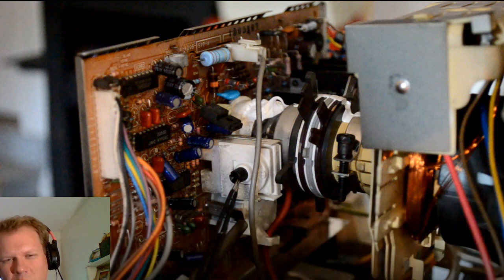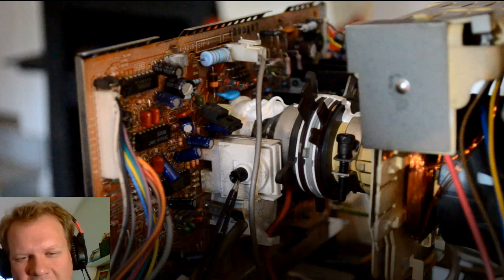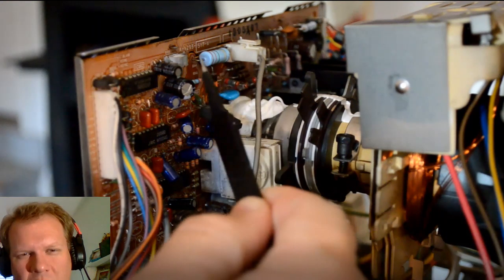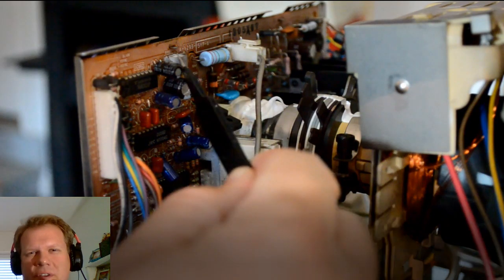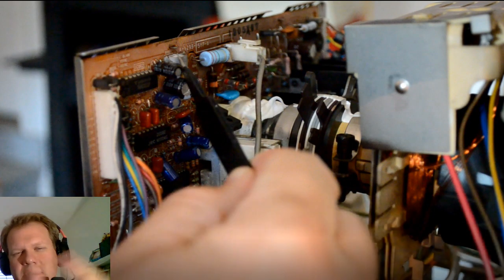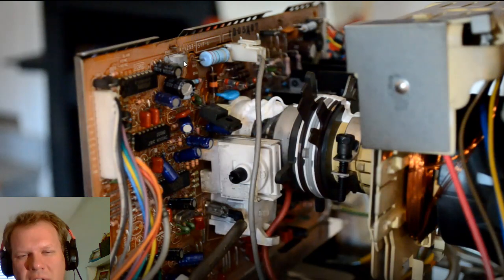So first we have this one on the side of this neck board right next to the neck of the CRT. And if we turn that, you know, we could control some of the controls like screen convergence, that automatic screen convergence, horizontal static convergence. And then we've got, of course, convergence rings. And then this up here where I'm pointing at, this is your G2 voltage. So this could turn up the amount of voltage you have going directly into your tube.